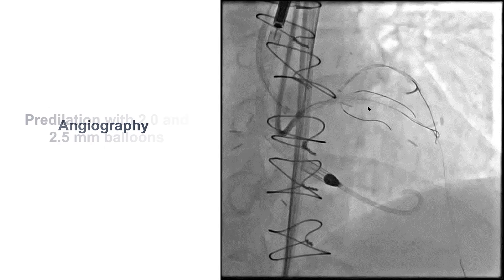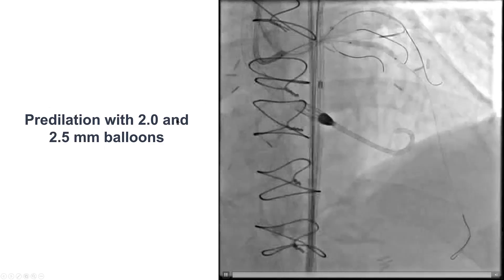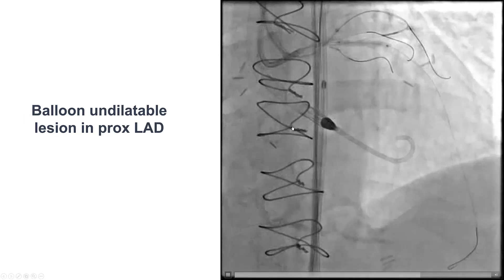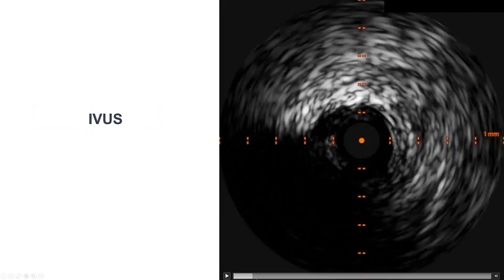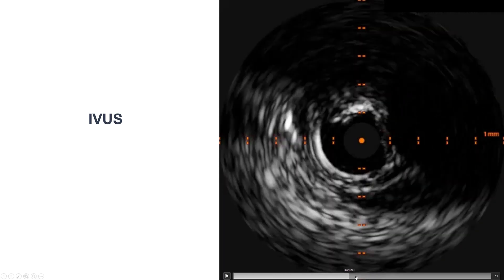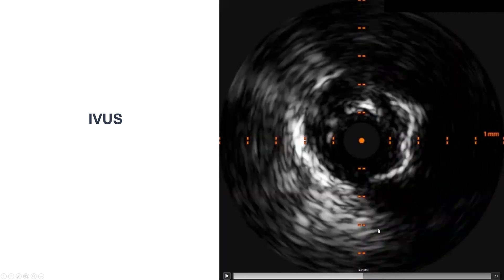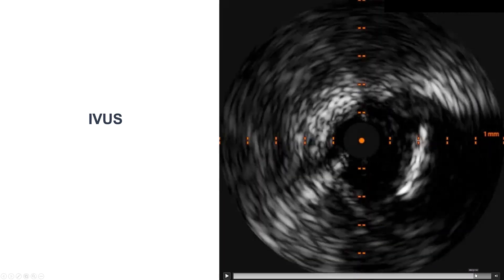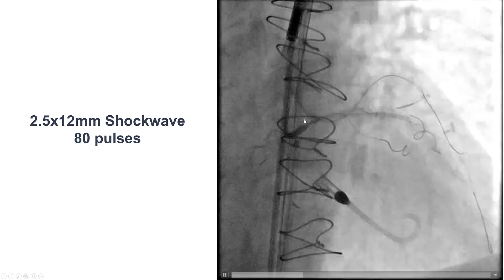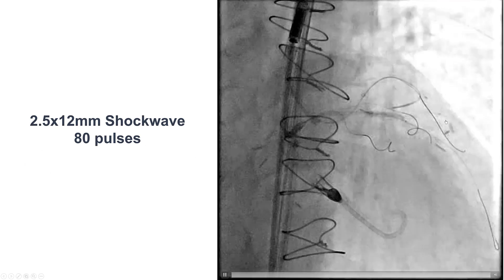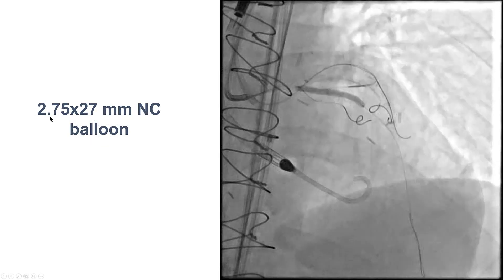This is the angiography. After performing balloon angioplasty, we did 2.0 and 2.5 mm balloons. However, there was difficulty expanding the lesion in the proximal LAD that was heavily calcified, as confirmed by intravascular ultrasound — there is extensive calcification. We did high-pressure inflation with a non-compliant balloon, and eventually we decided to use intravascular lithotripsy with a 2.5 mm balloon, which then allowed a 2.75 mm balloon to successfully expand.